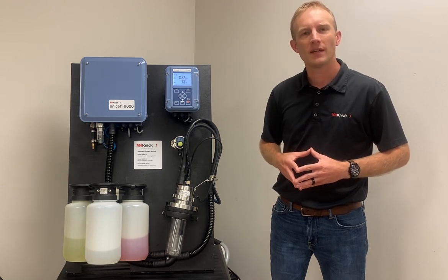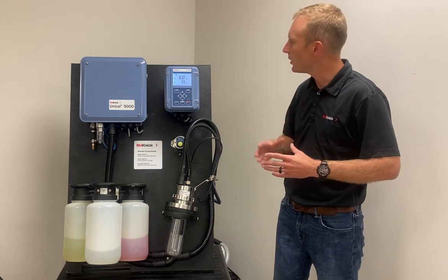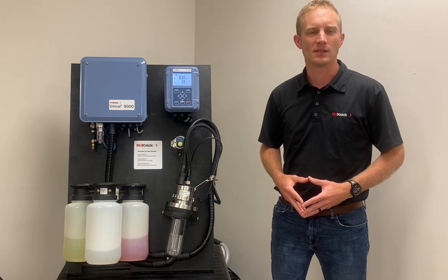So that's a general overview of the Unical 9000 automated system. We're going to take a few moments in some additional videos to dive deeper into the functionality and the programming of the system.